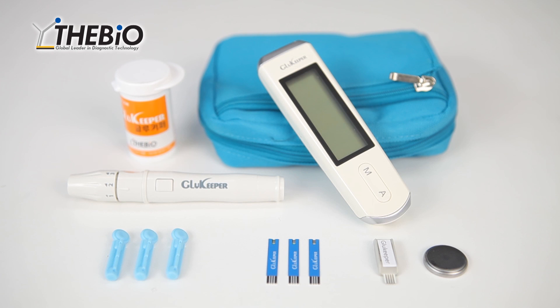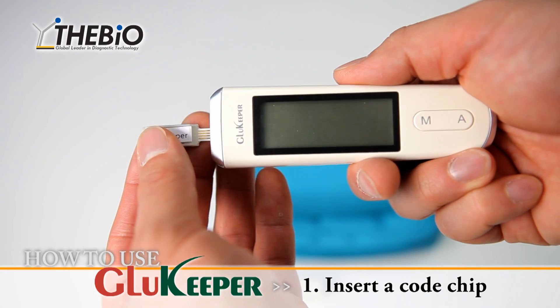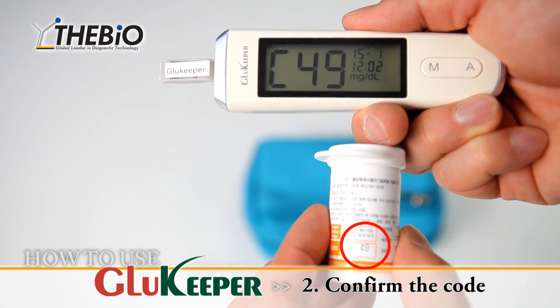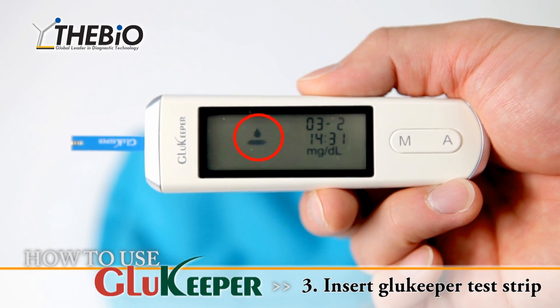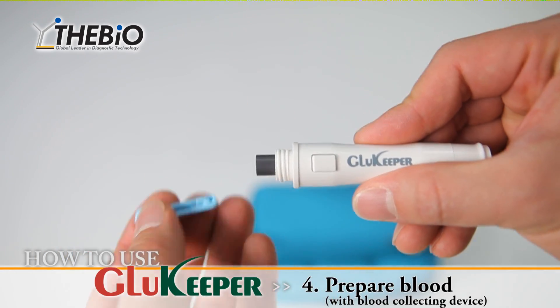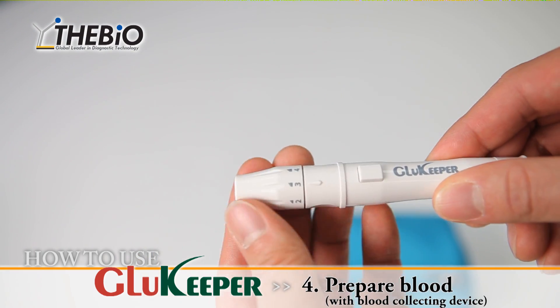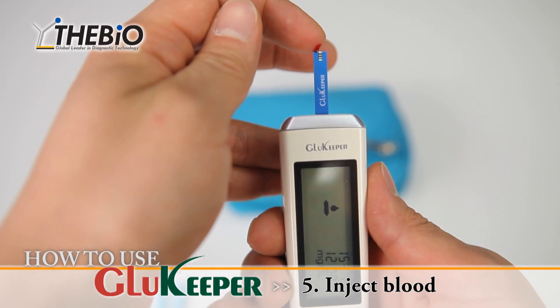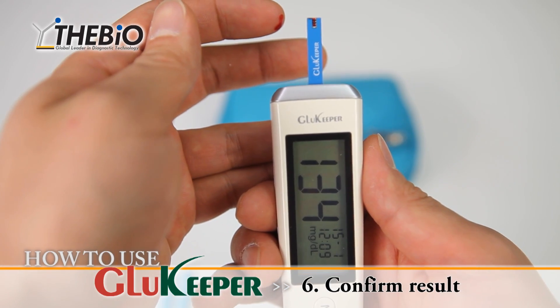Glue Keeper blood glucose measuring system is easy and simple to use. 1. Insert a code chip. 2. Confirm the code. 3. Insert Glue Keeper test strip. 4. Prepare blood and blood collecting device. 5. Inject blood. 6. Confirm result.